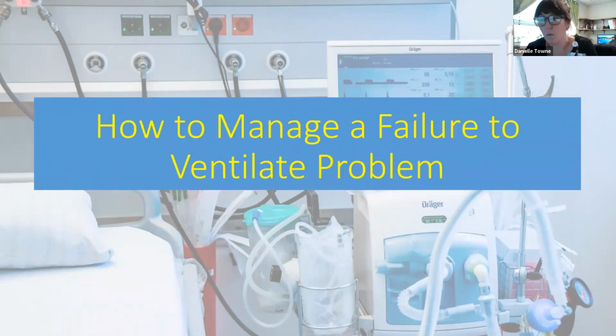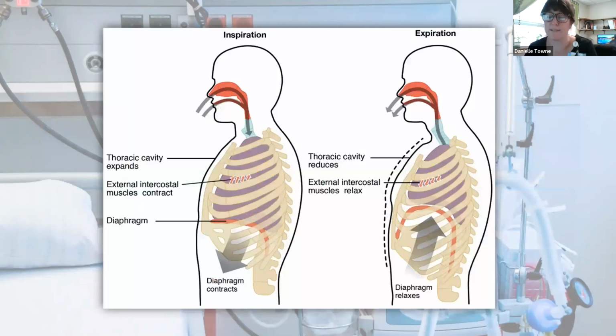When we have a patient that is a failure to ventilate, there's two ways that we can affect ventilation. We have our tidal volume and we have our respiratory rate, okay? And that's really it. Those are really the two big things that affect our ventilation and our ability to control somebody's ventilation. Remember what those two things make up is your minute ventilation, right? Your minute ventilation is what helps to affect your overall ventilation. So these two settings are what you would manipulate to best treat your failure to ventilate patients.